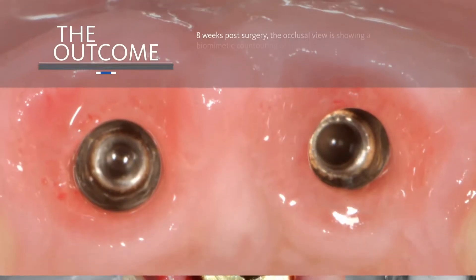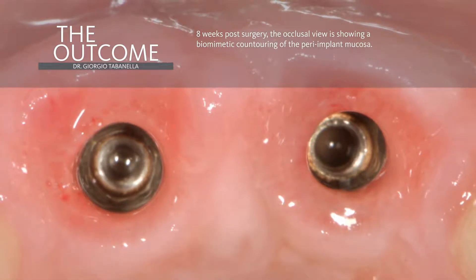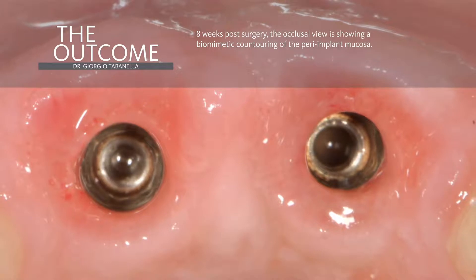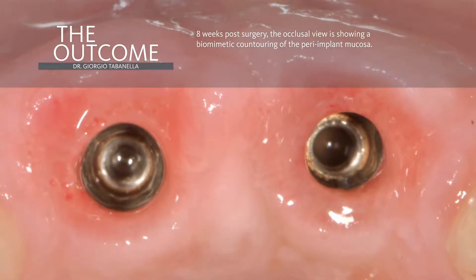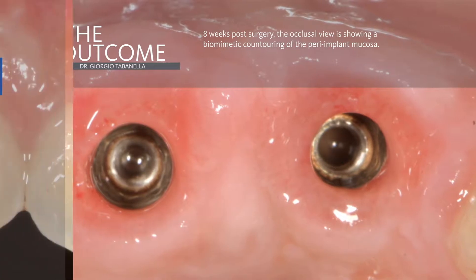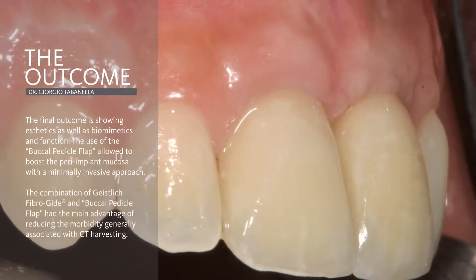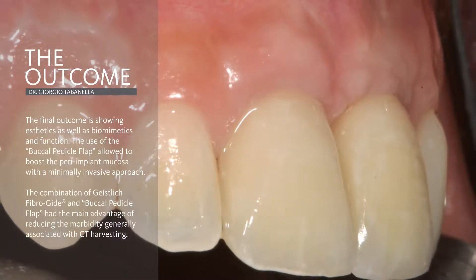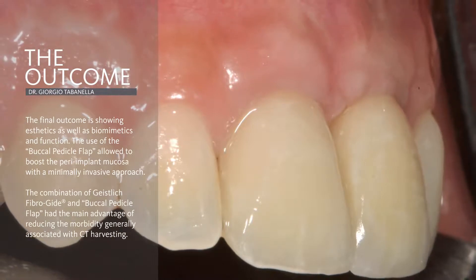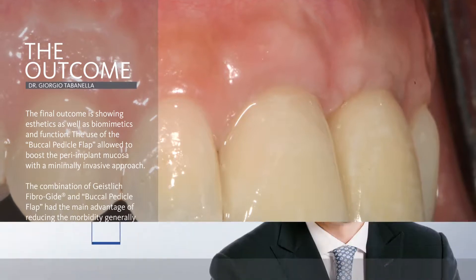This is the result after both buccalpedical flaps, eight weeks after, allowing the tissue to mature properly. We do have a good thickness of the peri-implant mucosa, a good band of keratinized mucosa, and finally a good biomimetic result at the level of both central incisors after this long period of treatment.